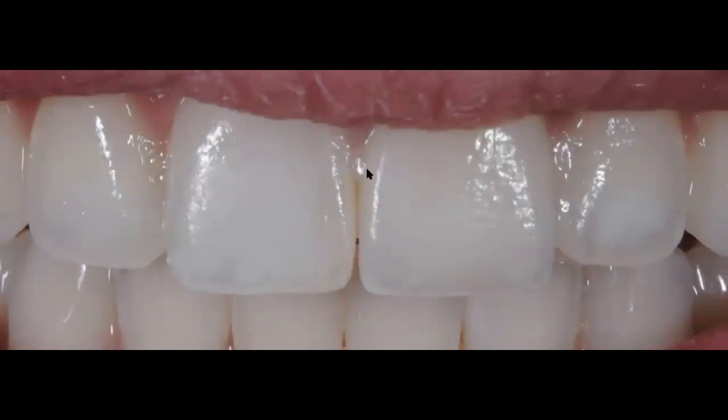Now I'm trying in the restoration with the try-in paste of the cement that I have selected, but look at the way that the shade blended in. And this was the first restoration, so we never repeated this restoration. I feel proud when I say that, because if you look at all the information that I gave the lab, wouldn't you think we should be able to achieve this type of result? Because we're giving the lab so much information.